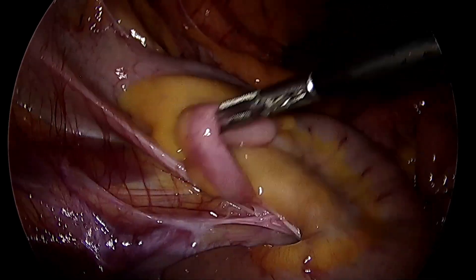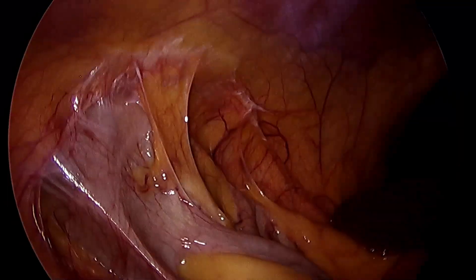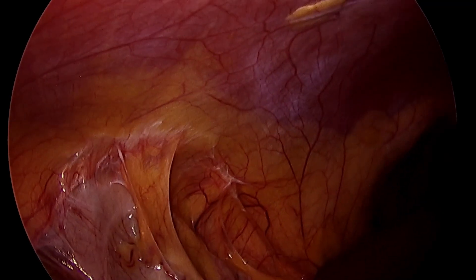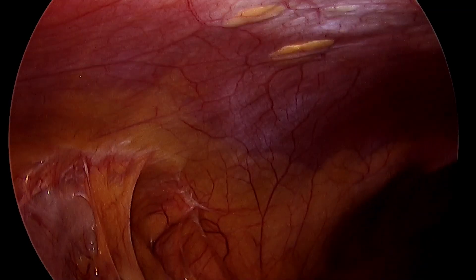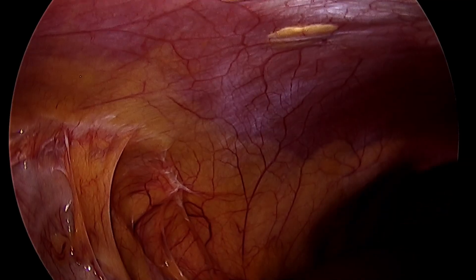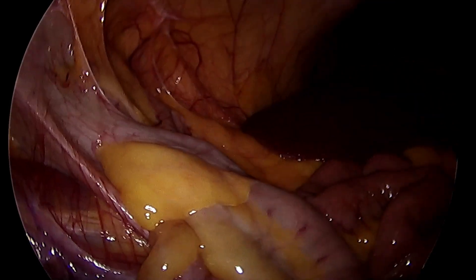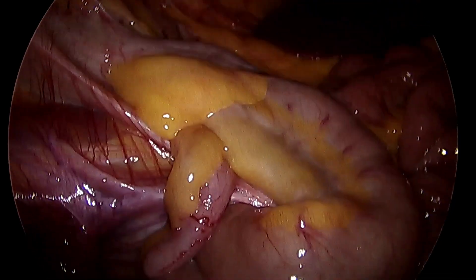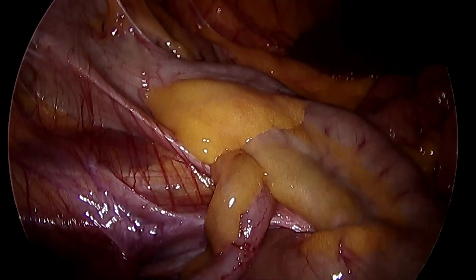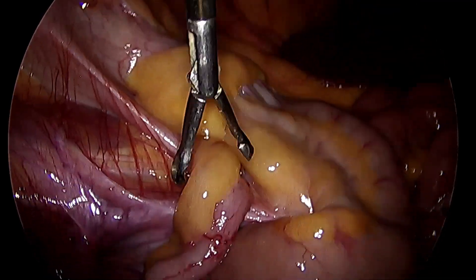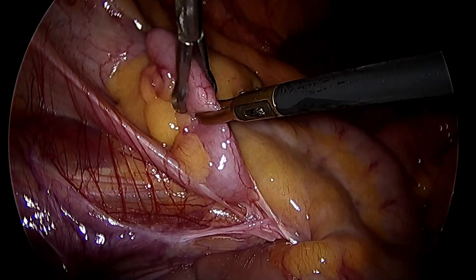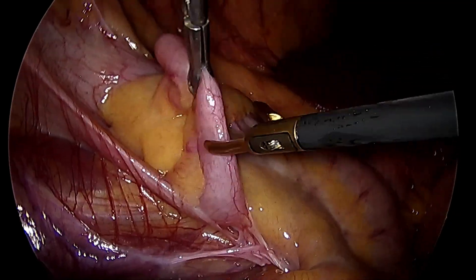I'm creating my left hand port a bit higher than where I should have done if it was only a case of appendectomy, so that I can use it comfortably to retract the gallbladder in the next part of the surgery. That's the appendix — you can see it's slightly inflamed.